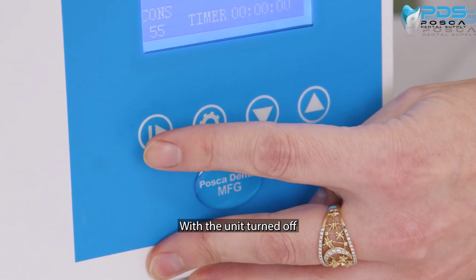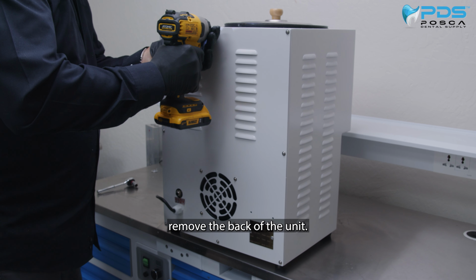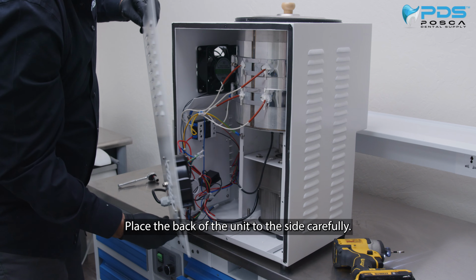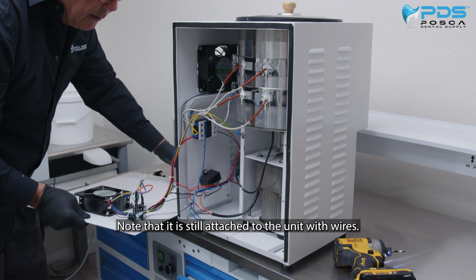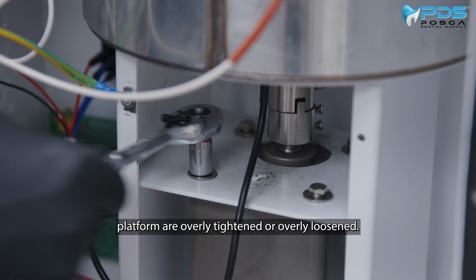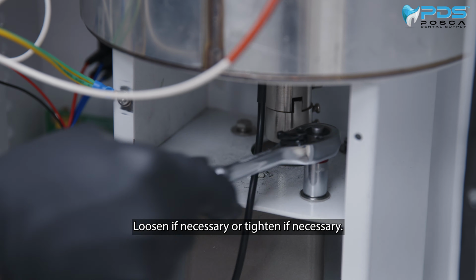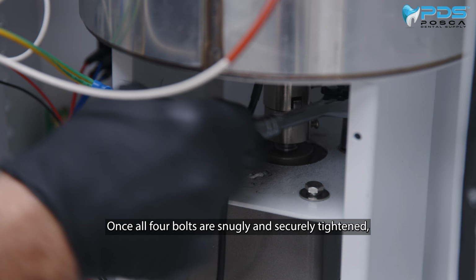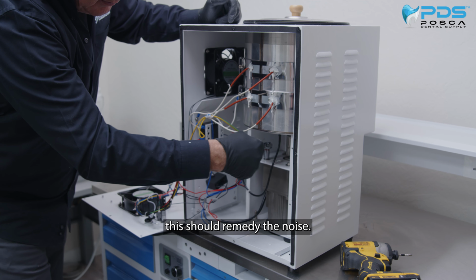With the unit turned off and unplugged from its power source, remove the back of the unit. Place the back of the unit to the side carefully. Note that it is still attached to the unit with wires. Be mindful. Check to see if any of the 4 bolts on the motor platform are overly tightened or overly loosened. Loosen if necessary, or tighten if necessary. Once all 4 bolts are snugly and securely tightened, this should remedy the noise.